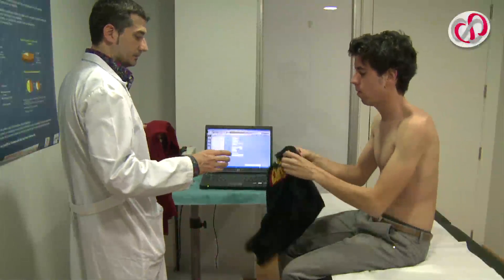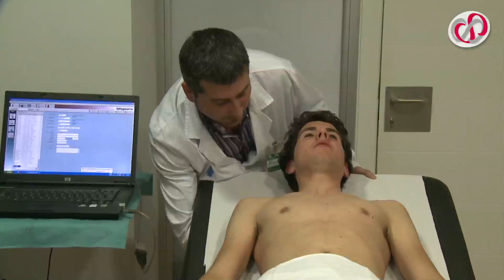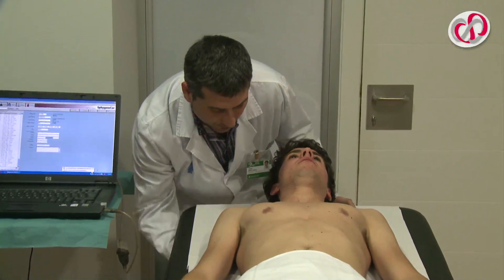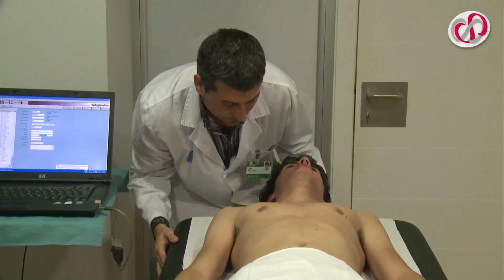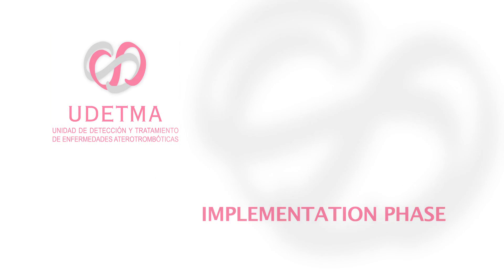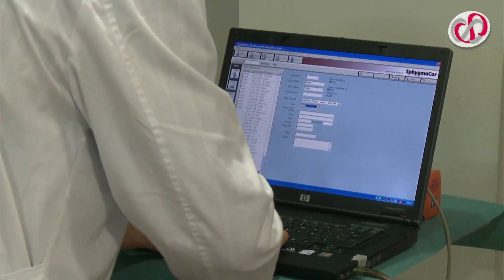He or she lies on the examining table in the supine position. Patient data are then introduced into the computer.